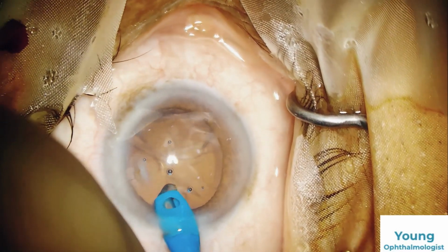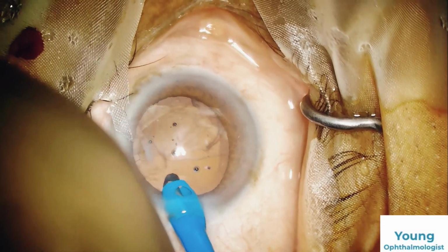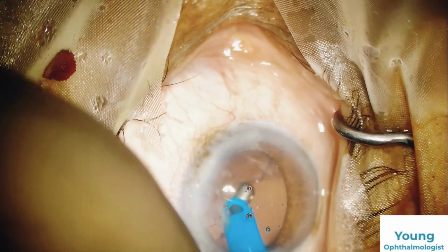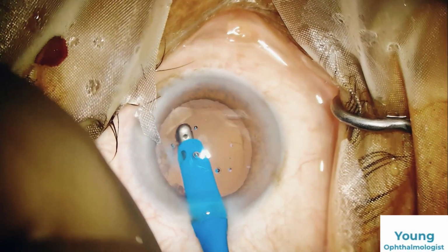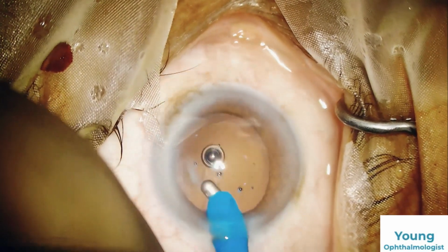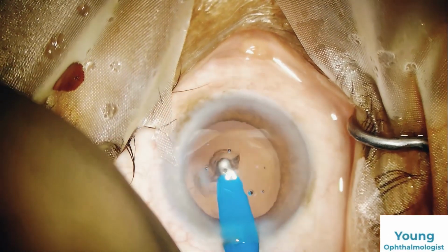You should never apply the full vacuum at the periphery. Only once you come to the center you can apply it. In the periphery you should have a low vacuum. You aspirate, hold and bring it to the center to apply the full vacuum.